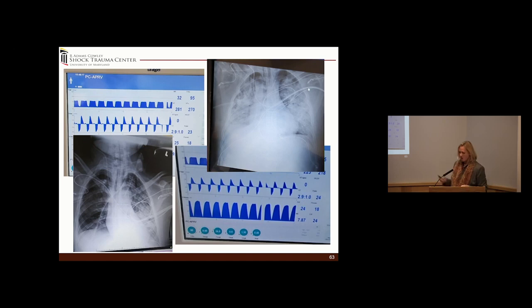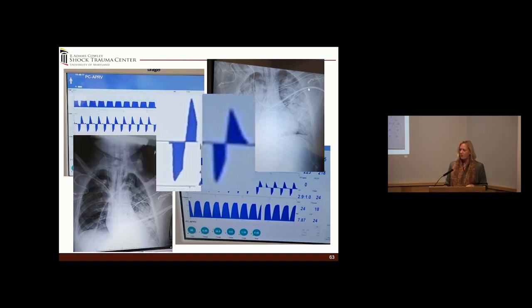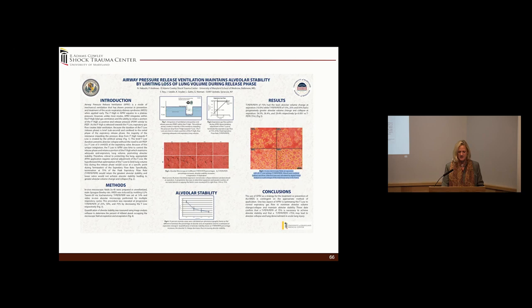And look at the loss. So now, just to blow it up, look at the angle changed. This is a little blurry, sorry, but I have a 45-degree angle here. It got steeper, and now my 75% is up here versus down there. So I needed to take that T-low and go from 0.45 back to probably about 0.35, I think, which is what we did.